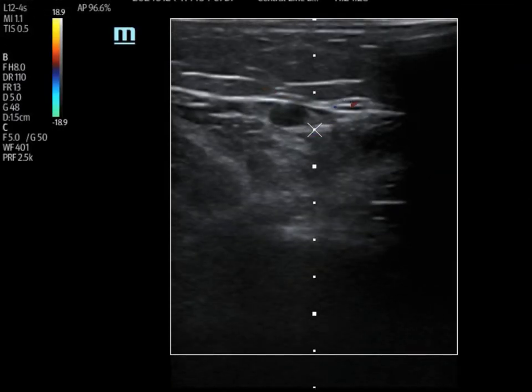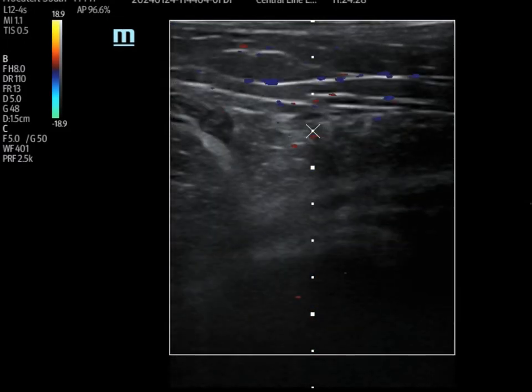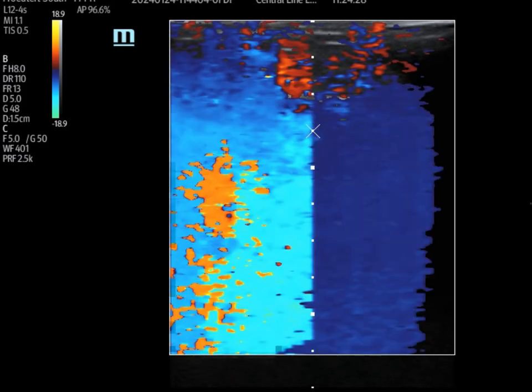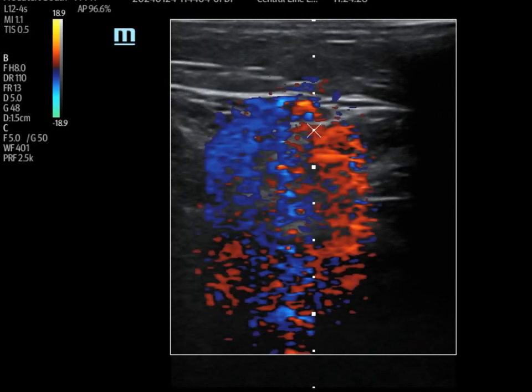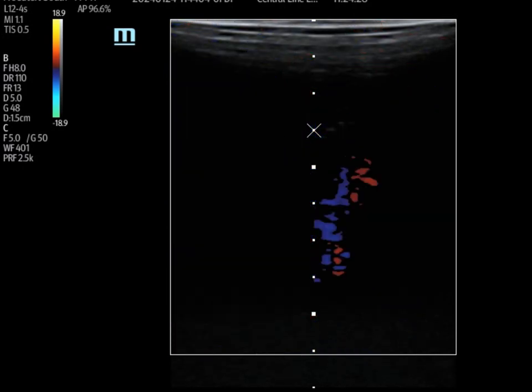This next clip stresses the importance of using color Doppler. I've been called to many rooms and asked whether an IV is still functioning. You scan the vessel proximal to the insertion site, put on color flow, hook up a flush, and then do a power flush. You don't need color Doppler, but it really is definitive confirmation that you are in fact still in the vessel.